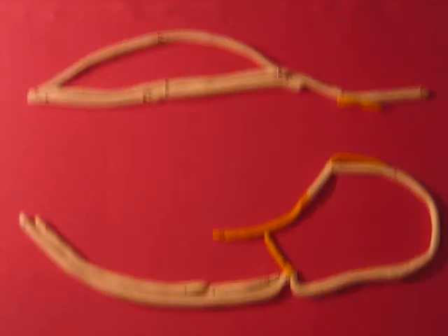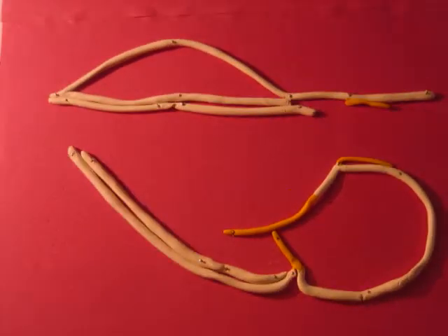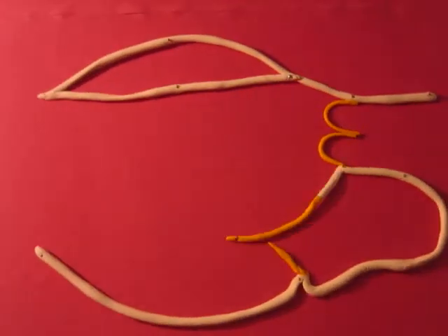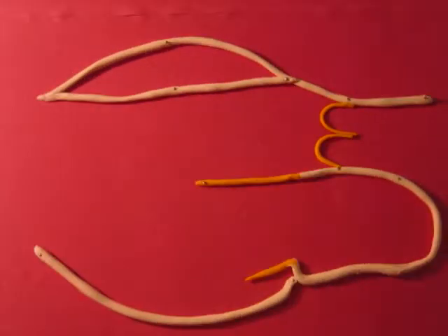When the heart is in systole, the heart contracts to pump blood throughout the body. To figure out how well the heart is pumping, we use an echocardiograph. This allows us to examine the heart in a 2D plane. From this view, we can take measurements to determine how efficiently the heart is pumping.